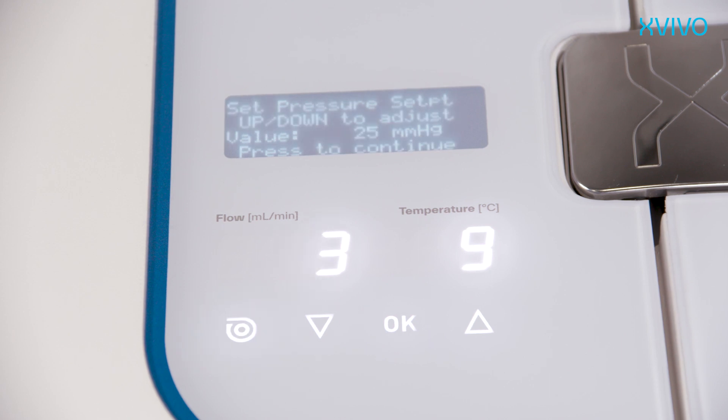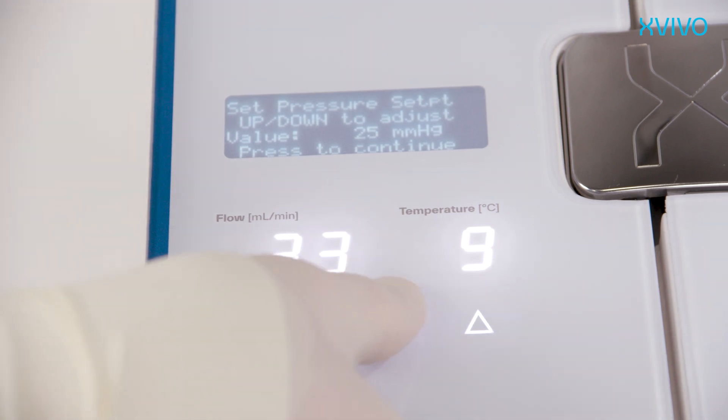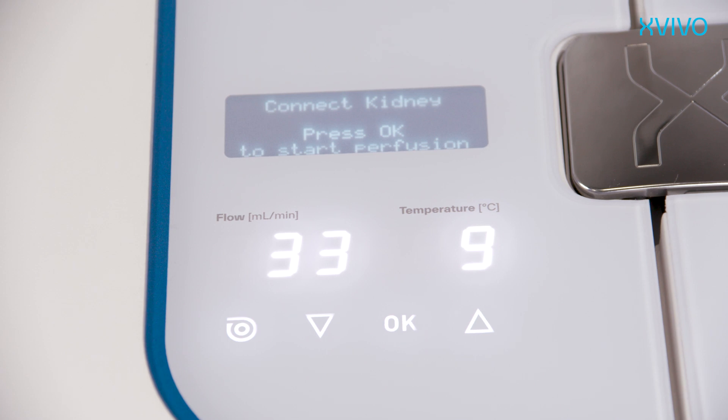The system will automatically calibrate the pressure sensor. The pump stops while pressure is being zeroed in 8 seconds. After zeroing, the system will automatically proceed to the next step. Set the preferred perfusion pressure — the recommended pressure setting of 25 mmHg is default. Press the OK button to confirm and to proceed to the final step. The display will show 'Connect Kidney.' Do not confirm this step by pressing OK until the kidney is placed and the reservoir is closed with two lids.